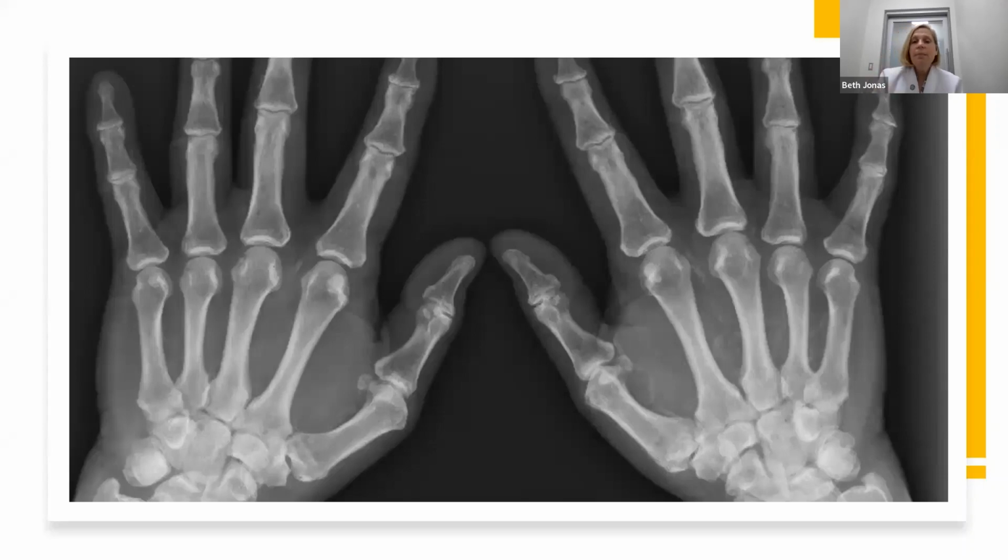So this is an example of a patient that has calcified arterial structures, and you can see that really all through the hand. Sometimes it's so obvious you can make out all of the structures, but you can see here, and here, and here, all of the arterial structures in the hand. So this is calcification of the arterial system, again, usually associated with metabolic syndromes, hypertension, CKD, and the like.